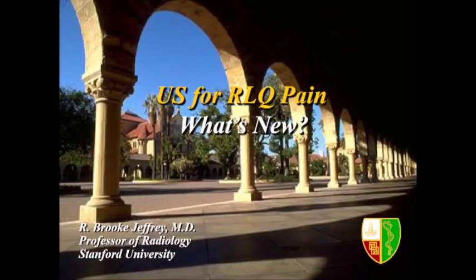The fact that we can diagnose with an inexpensive, readily available, non-invasive technique with no ionizing radiation and either rule in or rule out appendicitis is incredibly powerful. And not just for the patient and the patient's family, but really for our whole healthcare delivery system. And moving forward, as we transition to a paradigm where we're going to be treating appendicitis just like any other form of colonic diverticulitis with antibiotics, this will become even more and more important.